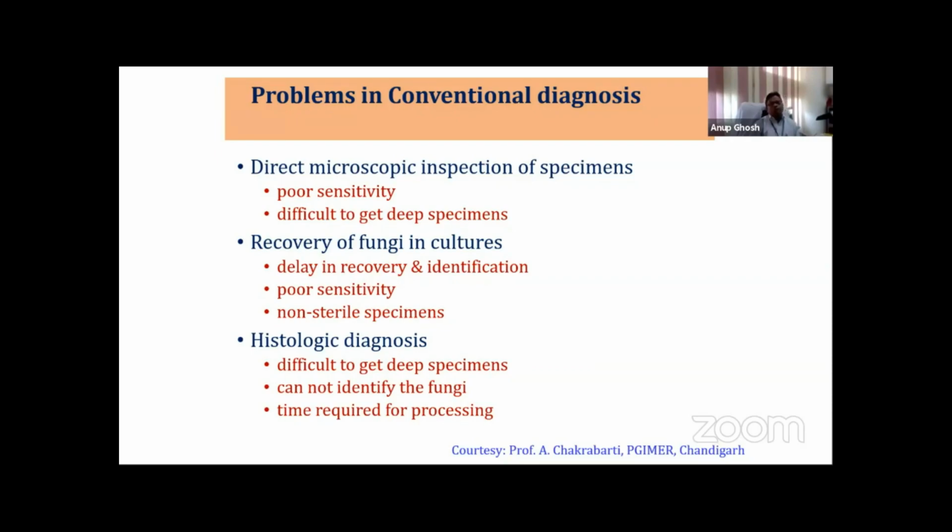the sensitivity is poor, and it is difficult to get the deeper specimen. In the case of culture, the recovery in the culture is very, very low. Some non-sterile specimens are a problem. And another problem is contamination.